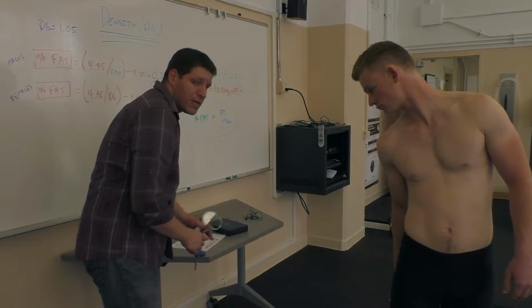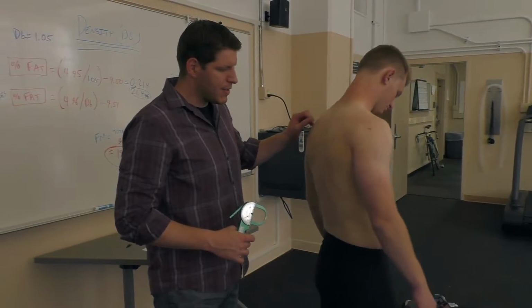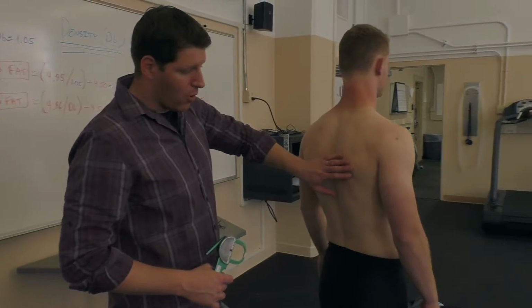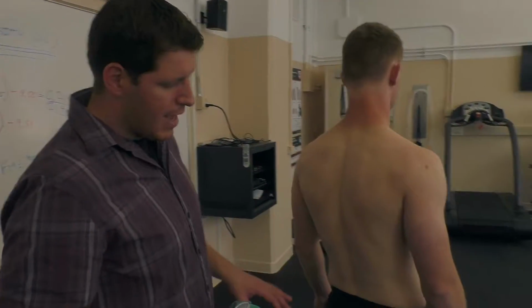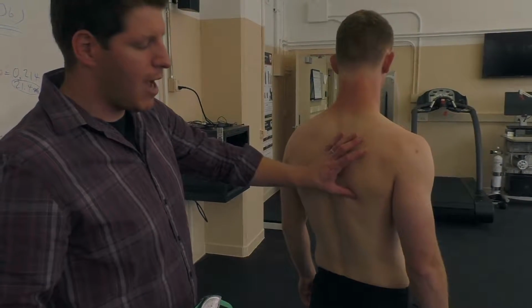Our 6th skin fold is actually my very favorite skin fold. Go ahead and turn around, Mr. Participant. This is the subscapular, by far my favorite skin fold. And sometimes it can be hard to find, especially when your participant has a fairly muscular back.